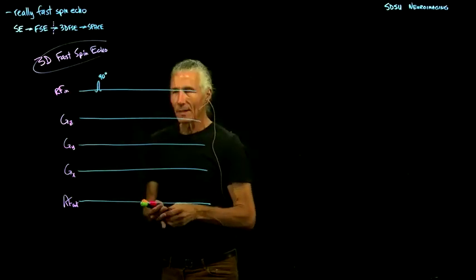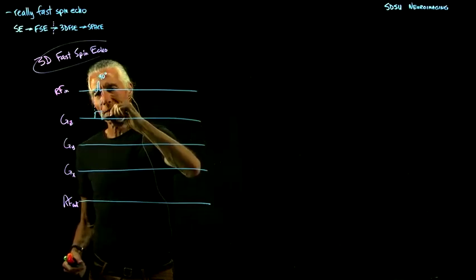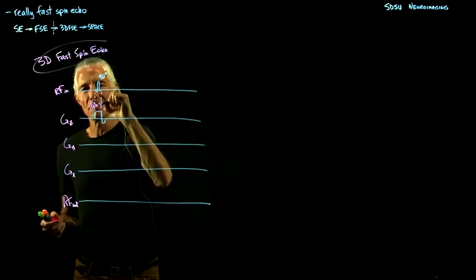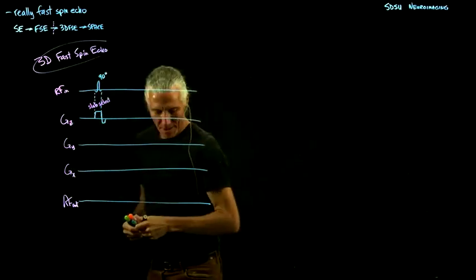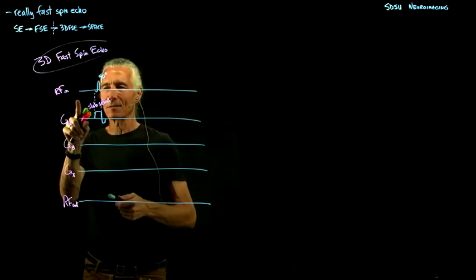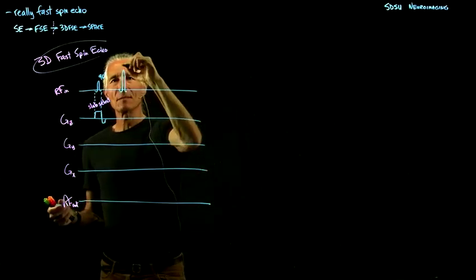The first thing is we select a slab. So this is a slab select. We still don't want to activate the neck, and so we essentially do a very thick slice that's like the whole head, and then there's pretty much almost nothing to the sequence. So this is the slice select direction, or the partition direction as we call it. And then we do 180 here because it's a spin echo.